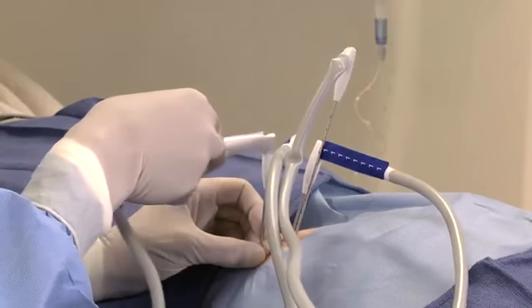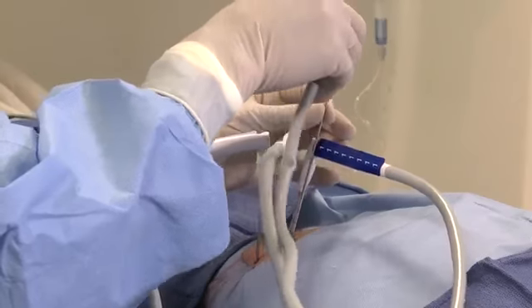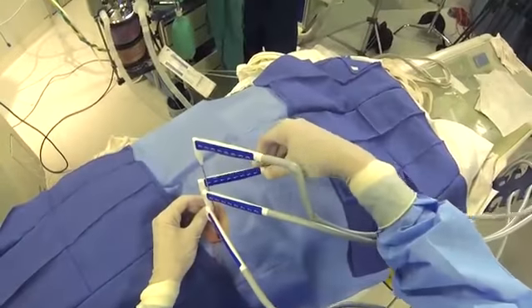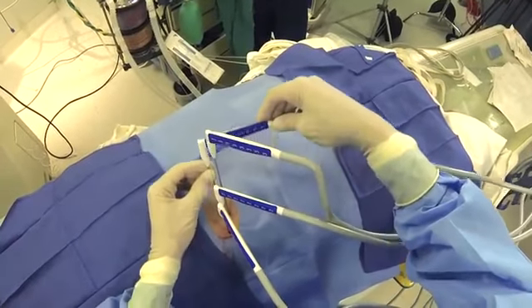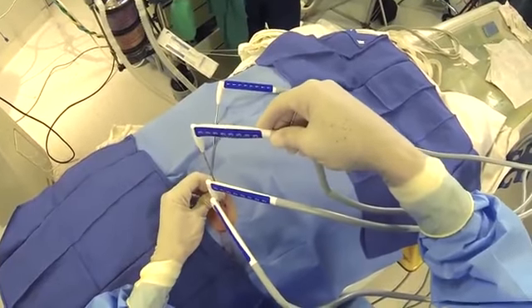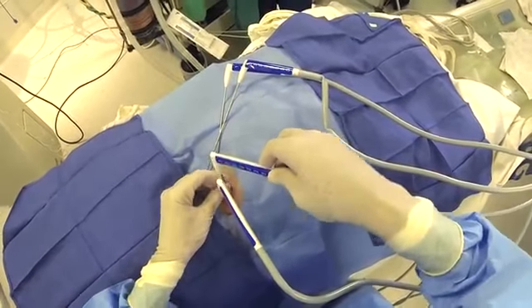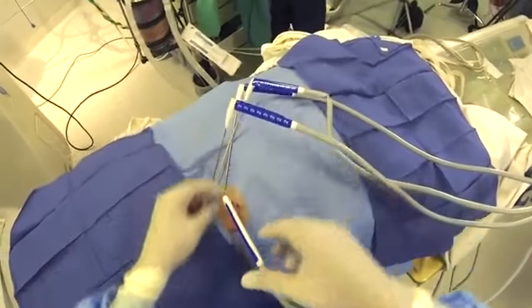Rocking the probe, that one's still stuck in place. You can feel them release and pop from the ice ball. This one's ready to come out. Very simply draws right out. Sometimes you'll feel a pop and a release.